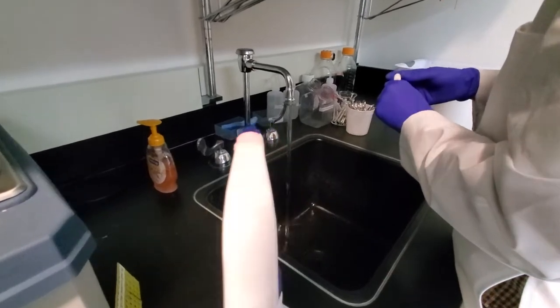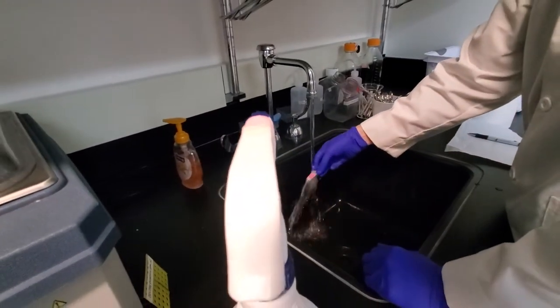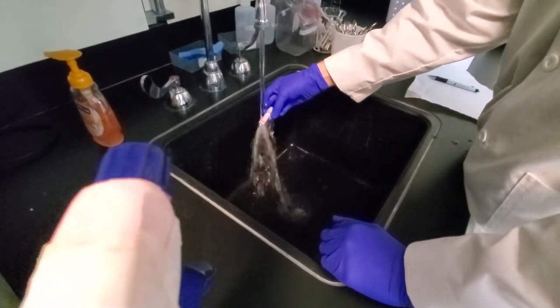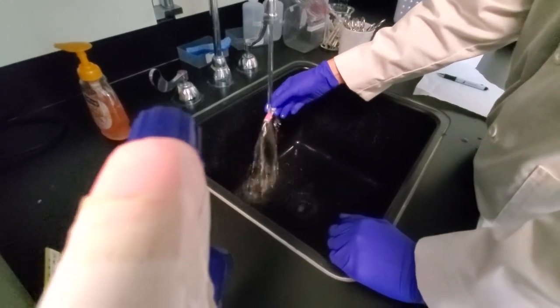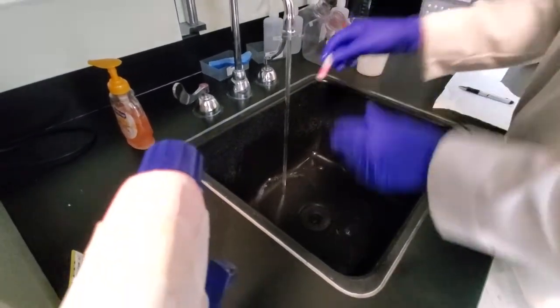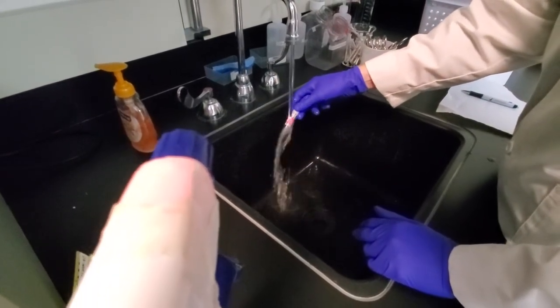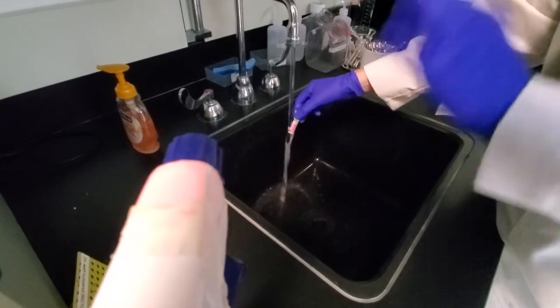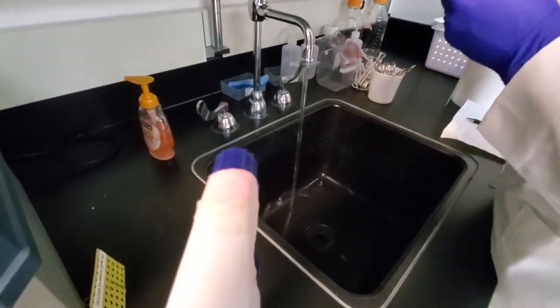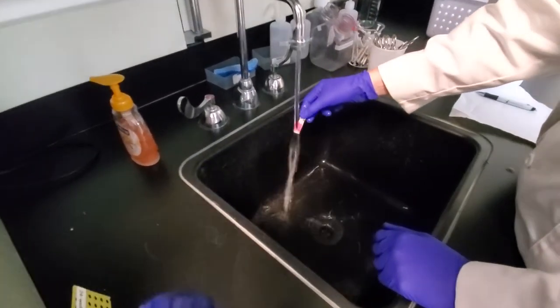Interesting, this one, the cap wasn't closed down all the way. This one was frozen in media, and I can tell that just because, since I freeze my own cells in FBS, it's a little more yellow. What we try to do is keep a close eye on it as it's thawing, and you want to stop this process when there's still a little bit of ice left, like a little ice crystal, and then move it over. So I'm just moving it around and checking it periodically.